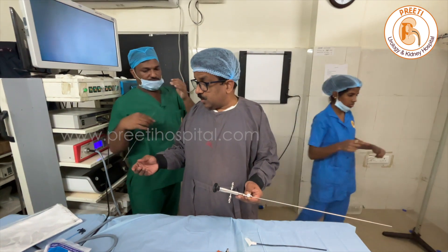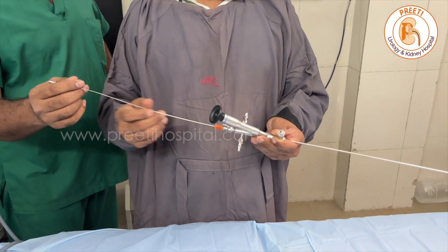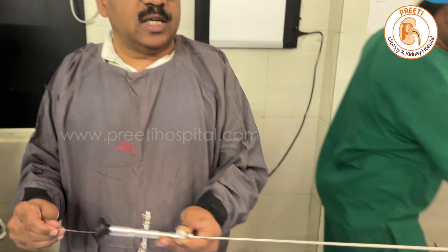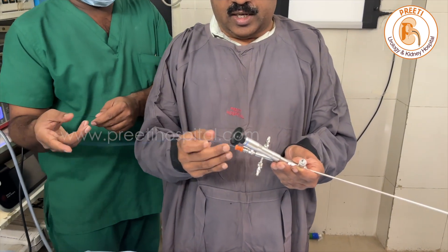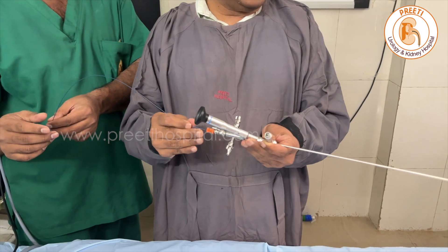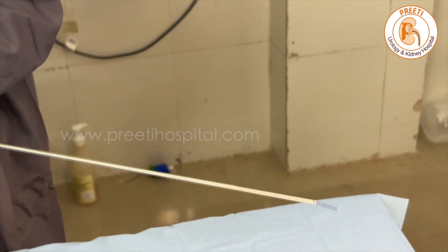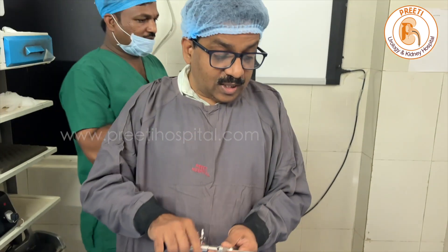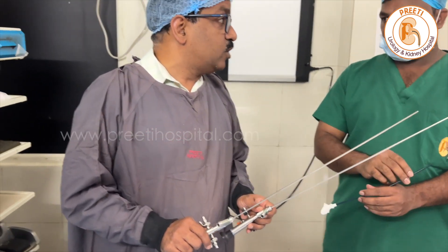If you insert the 0.8 mm rod, it is going — moving — but with a little difficulty. That means the lithotriptor rod of 0.8 mm also goes. The 3 French basket is going tightly; you can use a smaller basket, no problem. It is coming out at the end tip, but okay. So there is hardly any difference.